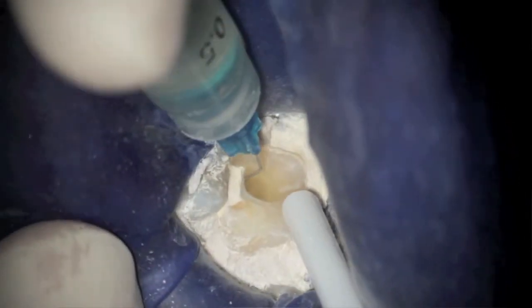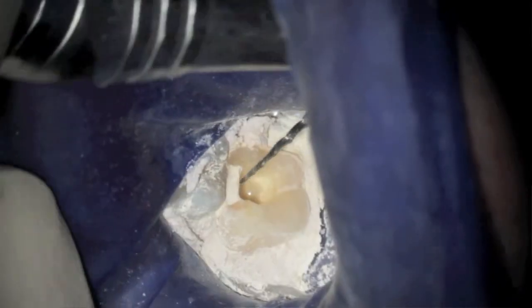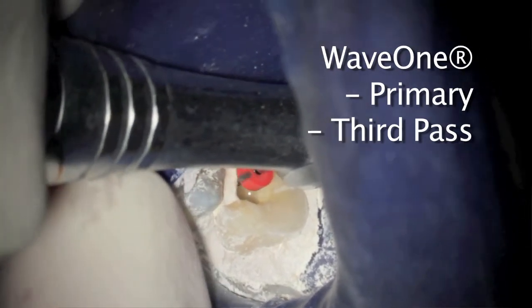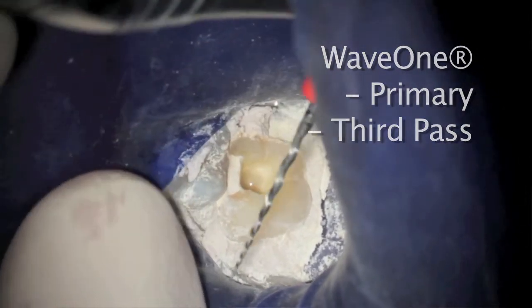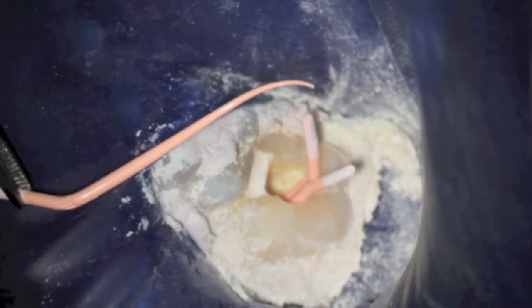The irrigating needle now penetrates more apically in the canal space. The Wave 1 is inserted a third time and this time it is able to achieve proper working length. This time the irrigation needle penetrates to within one millimeter of the predetermined working length. You are now seeing a radiograph of my working image with gutta percha cones in place at the predetermined working length. Take a look at the curve of this canal that is imparted to the gutta percha point as it is removed from the canal.